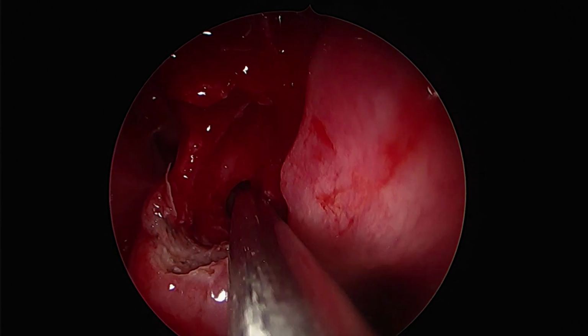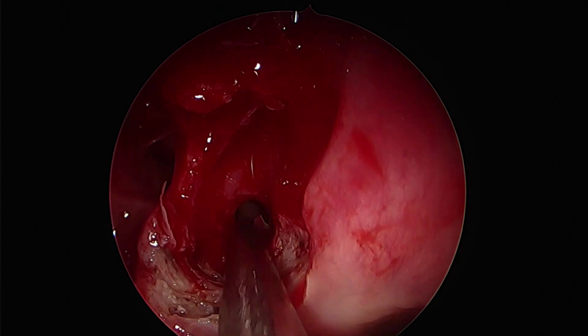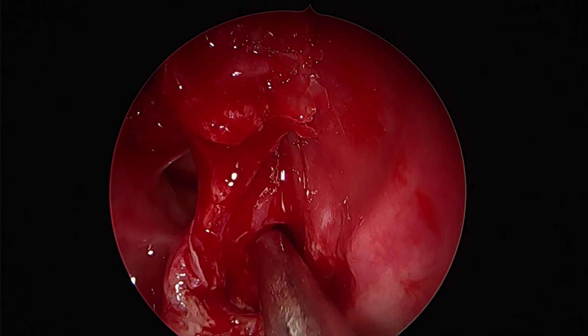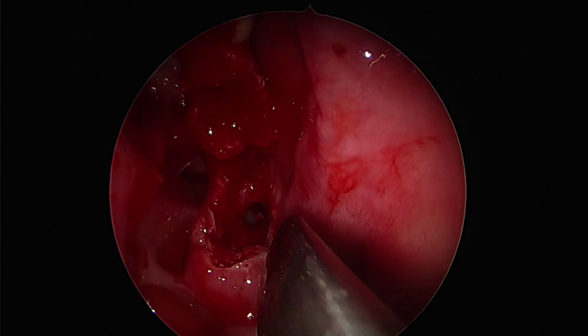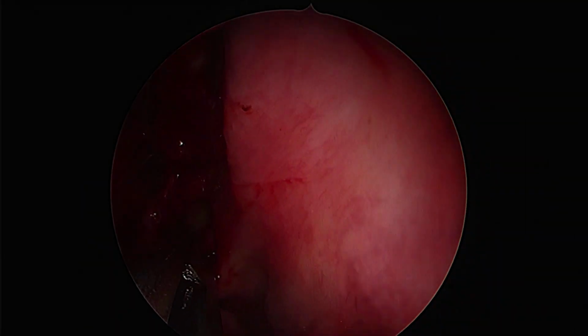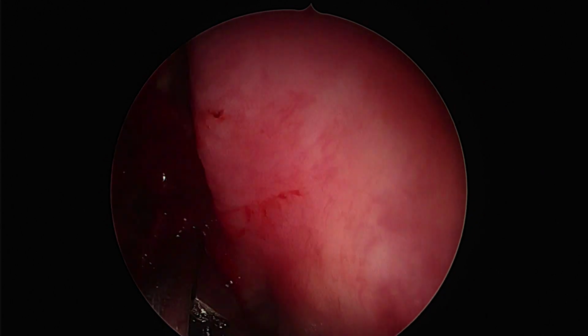The sphenoid os has been entered, but as of now we cannot identify anything about the Onodi or the septations. So this still needs to be enlarged safely before we can do any instrumentation or dissection inside the sphenoid cavity. In the presence of Onodi, it is strongly recommended that any entry point into the sphenoid, any dissection in the sphenoid, must be done post adequate widening.